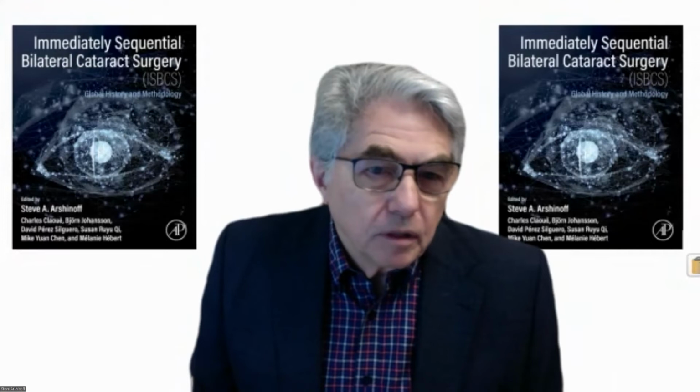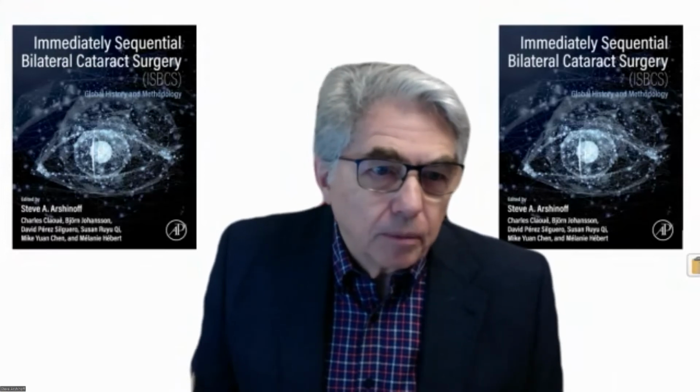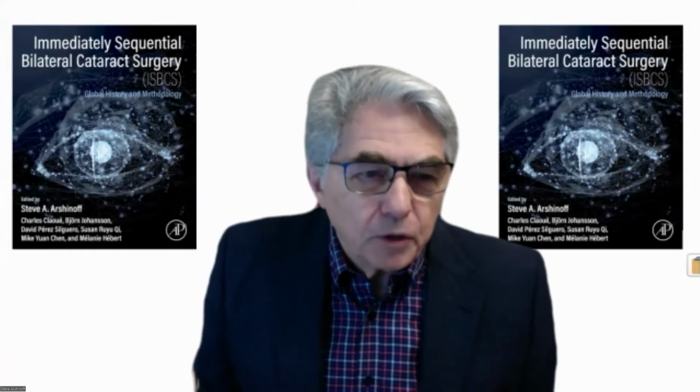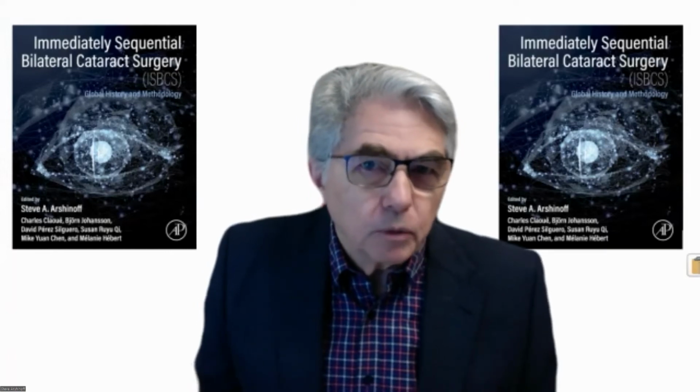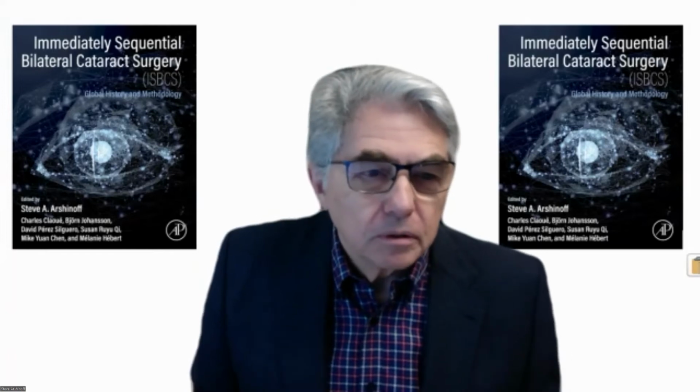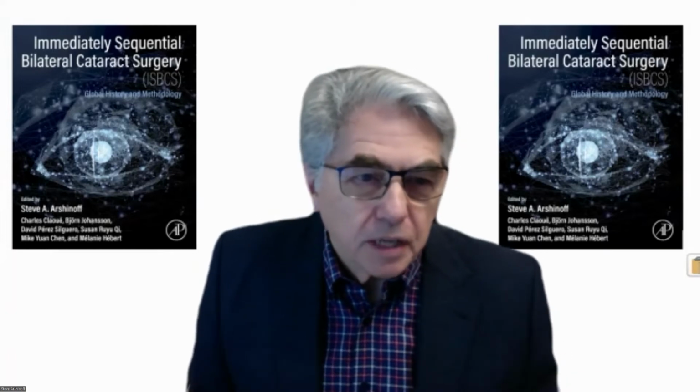And many companies will try to sell you the ideal average OVD for every case. But the problem is the regular cases aren't a problem. It's the unusual cases that are a problem. And so you really always find you have much more ability to do things when you have each OVD in a different syringe and you use it how you want to. Especially those of us who get sent difficult cases.